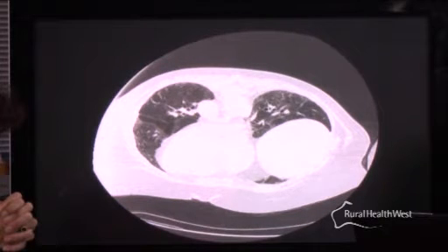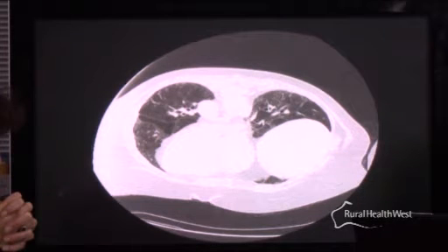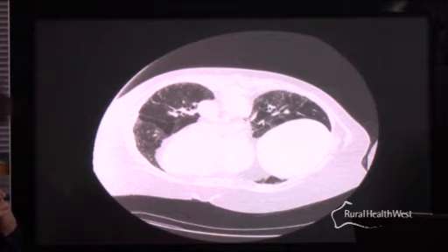And you can see that there's been 2 runs on the CT. The second half of the CT has been performed with the patient prone, and the first run supine. The reason why that is done is that we're trying to improve the aeration of the lung bases by turning the patient prone. And any patient who we suspect may have some form of basal pathology or interstitial lung disease, we would always do prone images at the end of the normal CT examination.